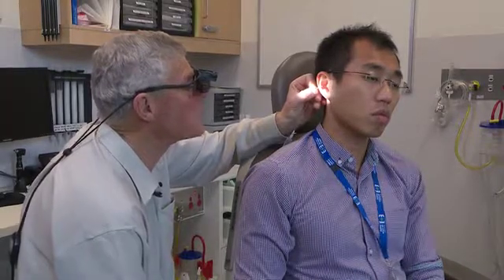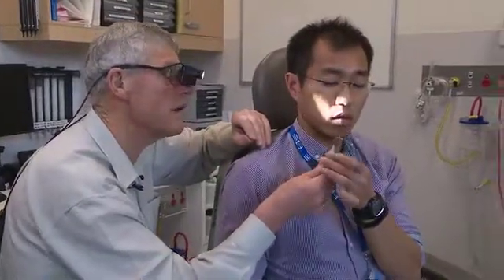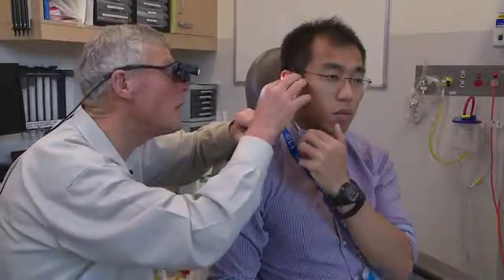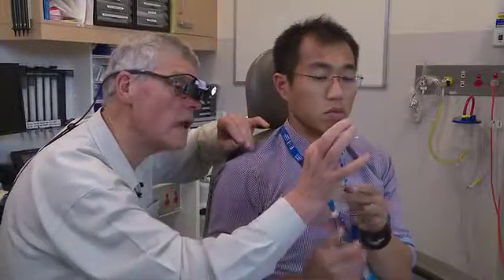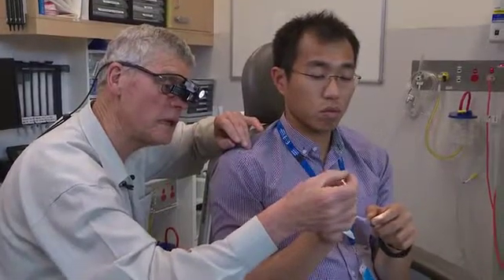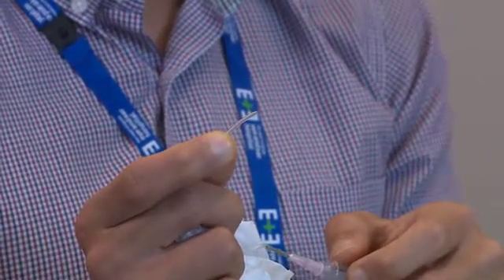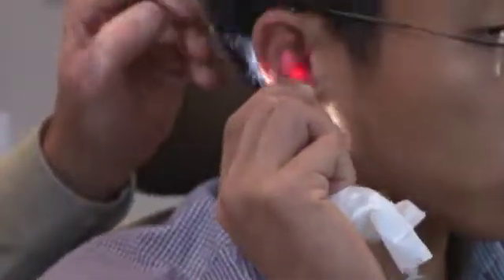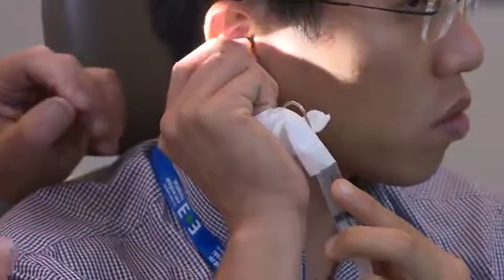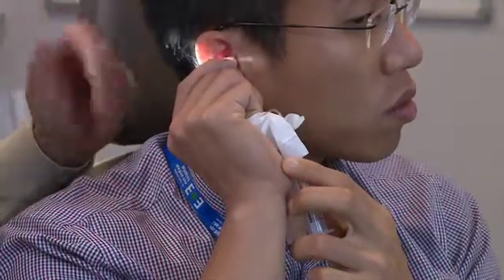Nearly always it's the child. So I'll hand that one off and say: can you just see how that works by giving it a squirt and feeling the air? Now what I want you to do, if you wouldn't mind, is hold it like that — so that will mean it can only go halfway into your ear canal, about 15 millimetres, a little bit less. It's enough to be fairly sure it's going to go. Now can you reach up and put that in your ear, and then blow air down on your eardrum? I'm watching that he's getting it in there — push your fingers in up against the tragus, that's right. Can you feel it puffing air on your eardrum? So you're nearly there with this do-it-yourself at home.